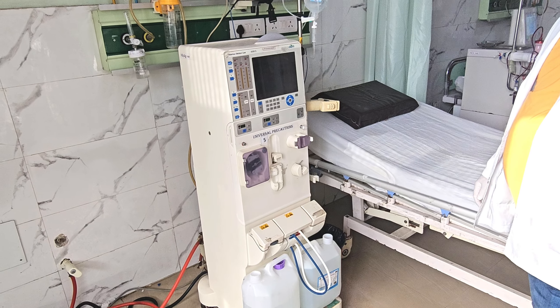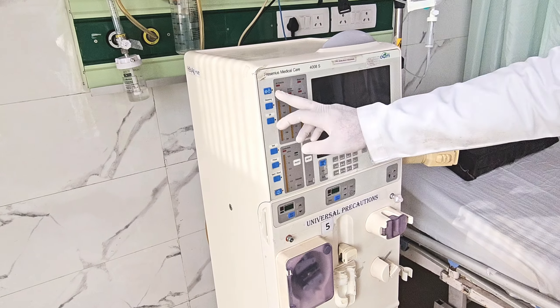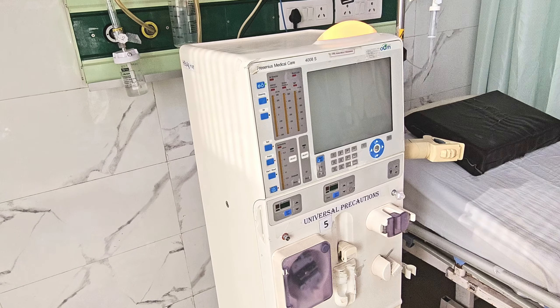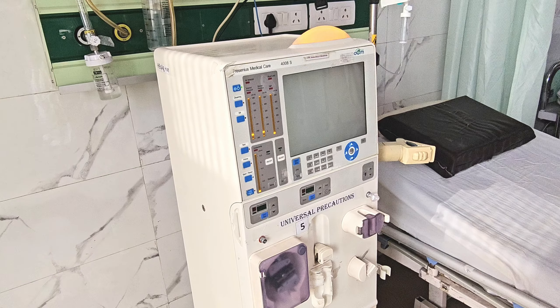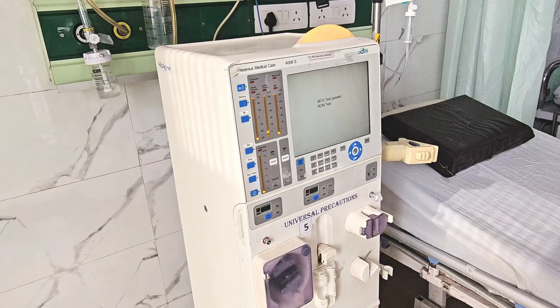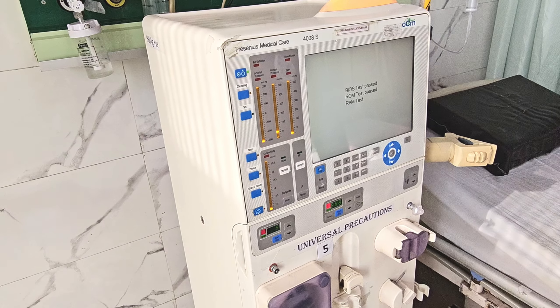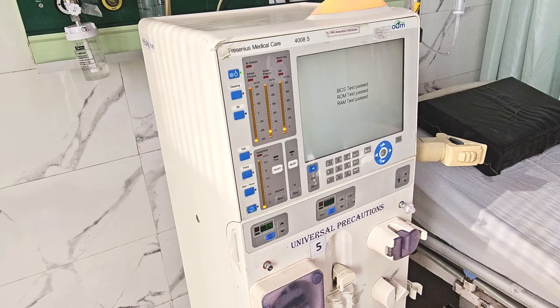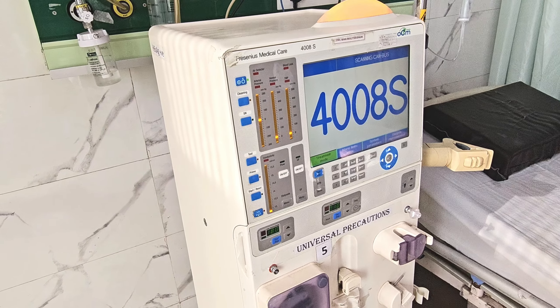In this video we will see how to operate the dialysis machine and how to initiate dialysis, starting from switching on the machine. This is the Fresenius machine. Once we switch on, the power supply is already connected to the socket. Senior dialysis technologist Mr. Krishna Kumar is demonstrating the procedure today.